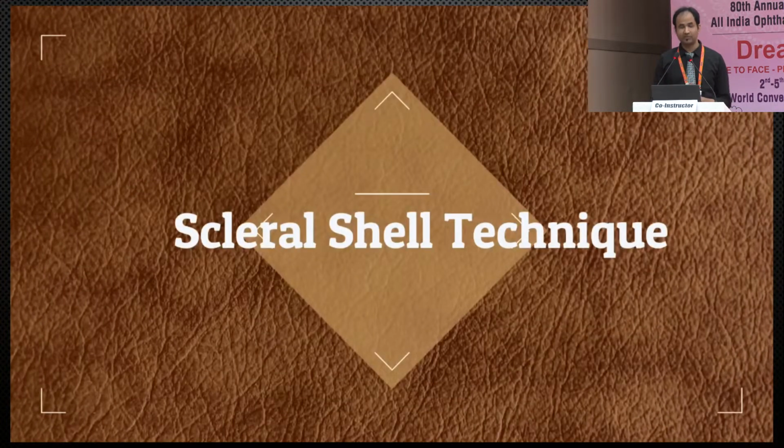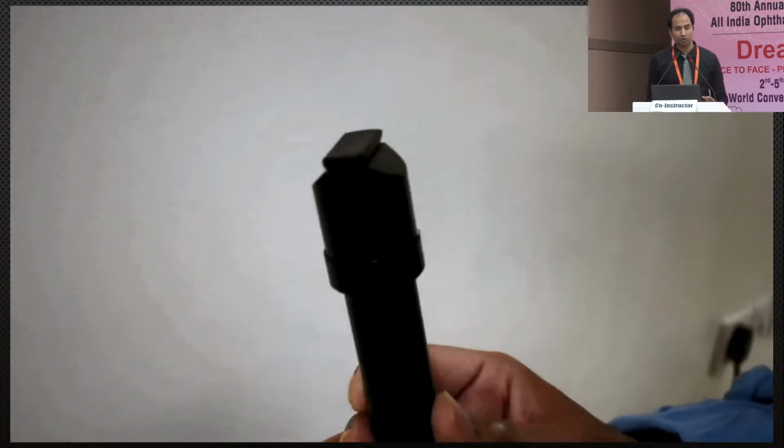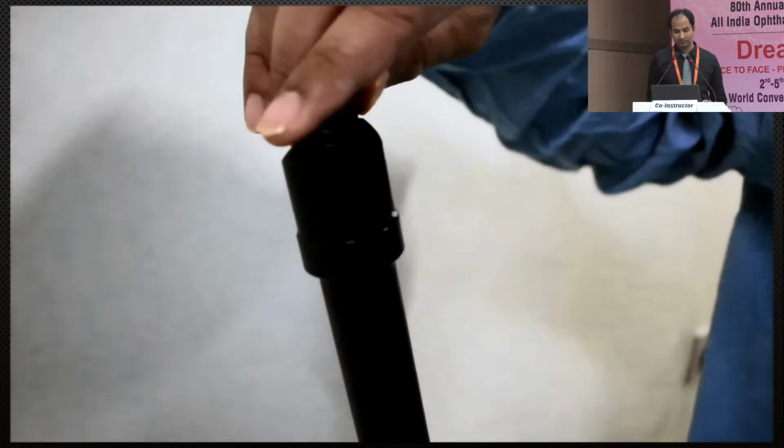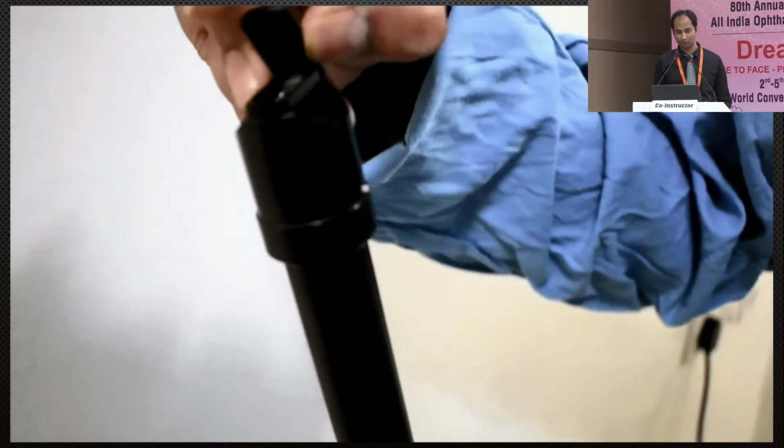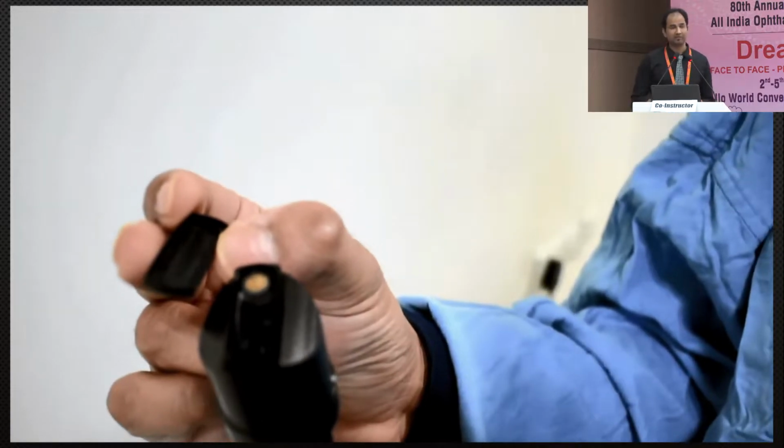So first I'll be demonstrating the scleral shell technique. It is the most common of all, which is done routinely. First we open the cover of the probe. Then there is a space. We need to fill this with distilled water.